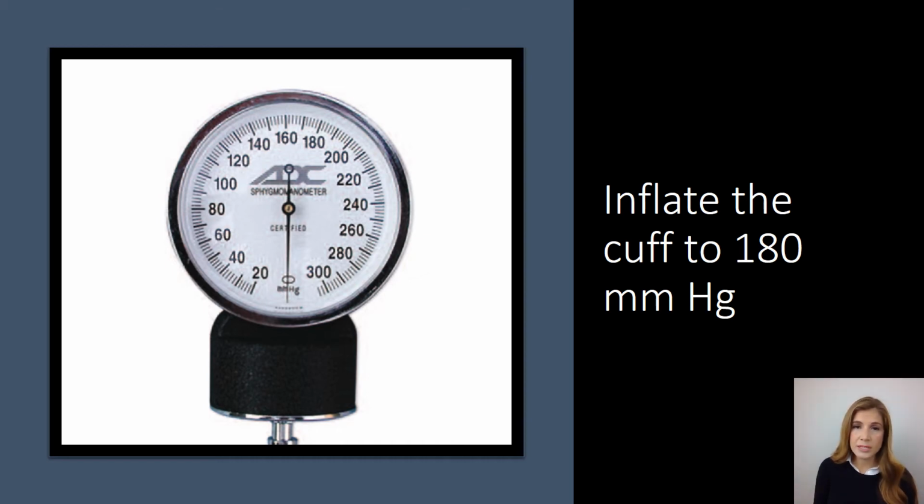It would be impossible to obtain anything other than an even number because each of those little lines that you see on this sphygmomanometer are indicative of 2. So you can see that it starts with 20, and then if you went to that next small line, that would be 22, and then this larger line would be 30.